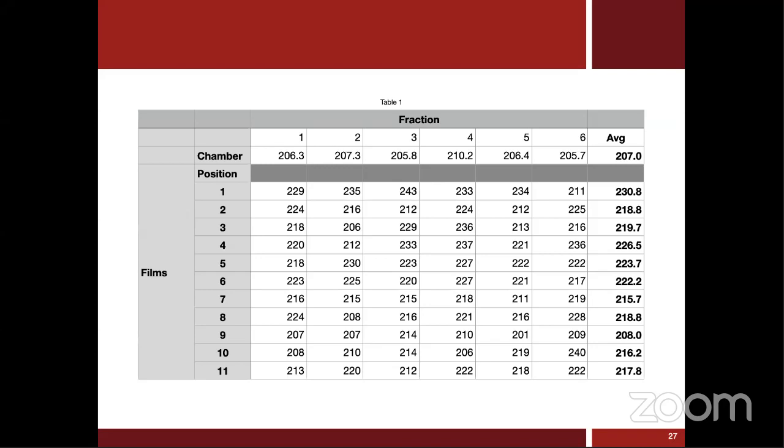By the way, the results for MOSFETs were very similar. So it's not like it was much better. So this tells me that it's about the packing, the rice bags.